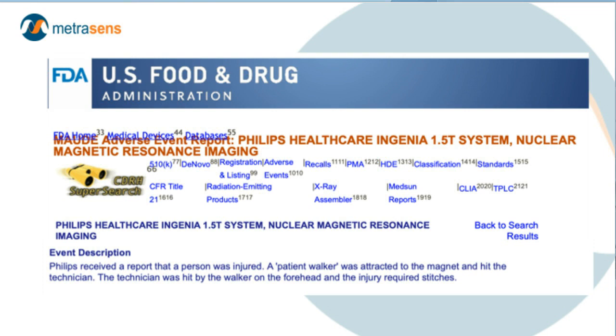But if we don't actually have a place to put those things, then it makes it very difficult to store them and keep them at hand. So simple things like a quarantine closet to lock up unsafe objects that patients bring with them to the MRI facility, and storage space to allow for things that are safe to use in the MR environment.